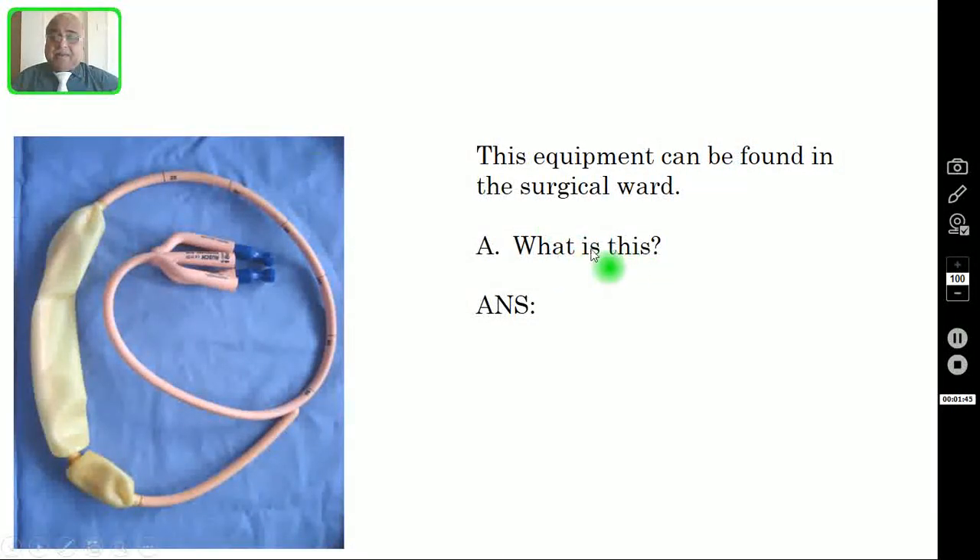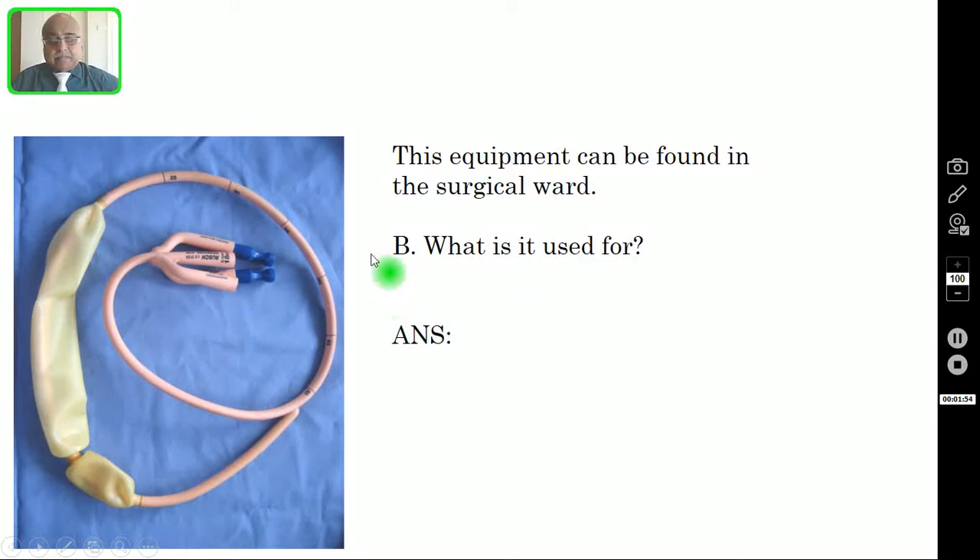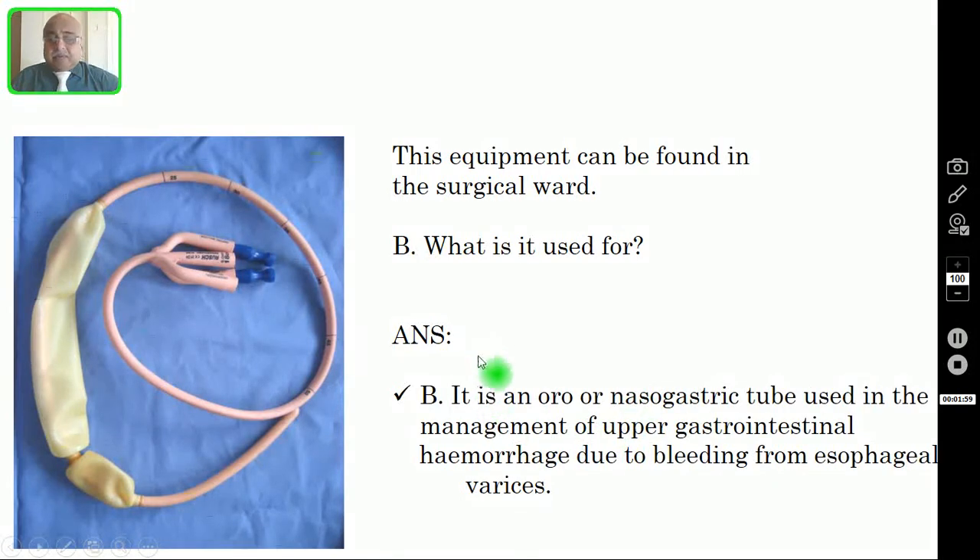Question number one: What is this equipment? The answer is this is a Sengstaken-Blakemore tube. Question number two: What is it used for? It is either an orogastric or nasogastric tube — meaning you can introduce it either orally or through the nose. It is used in the management of upper GI hemorrhage due to bleeding from esophageal varices.